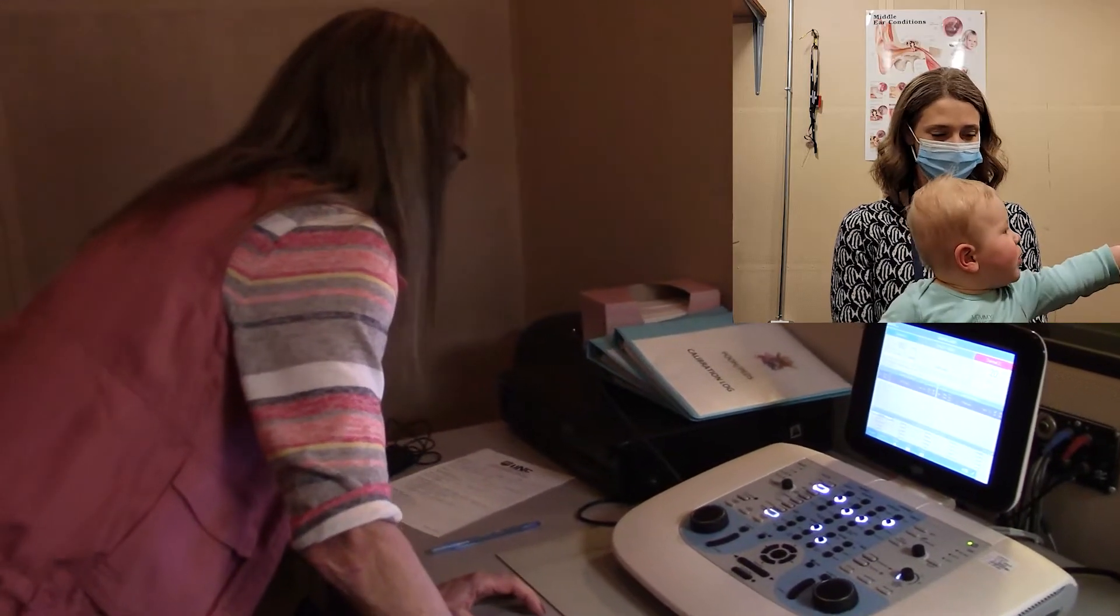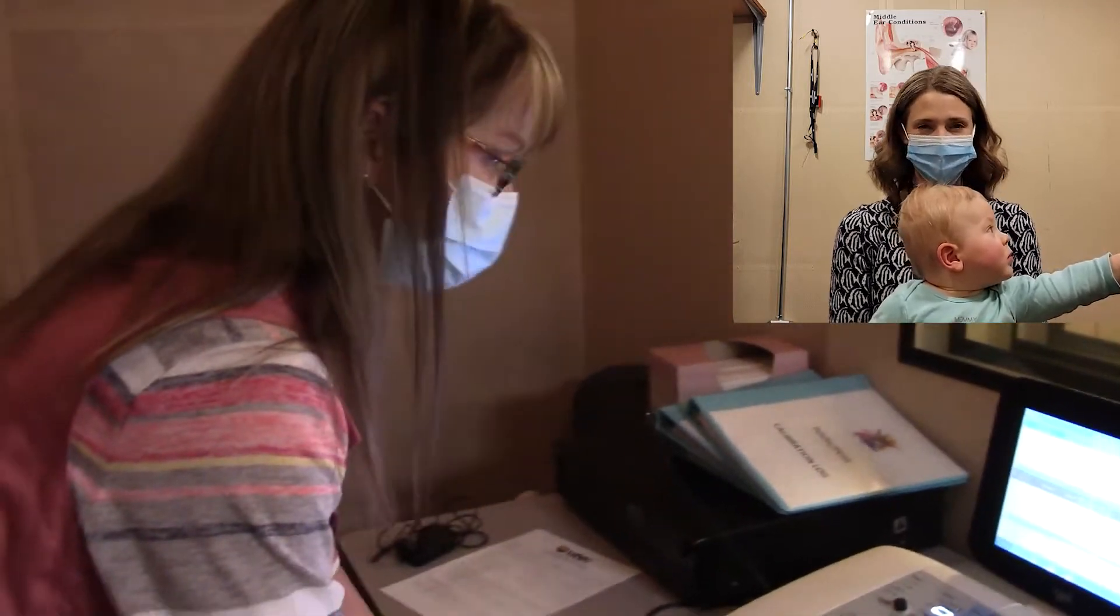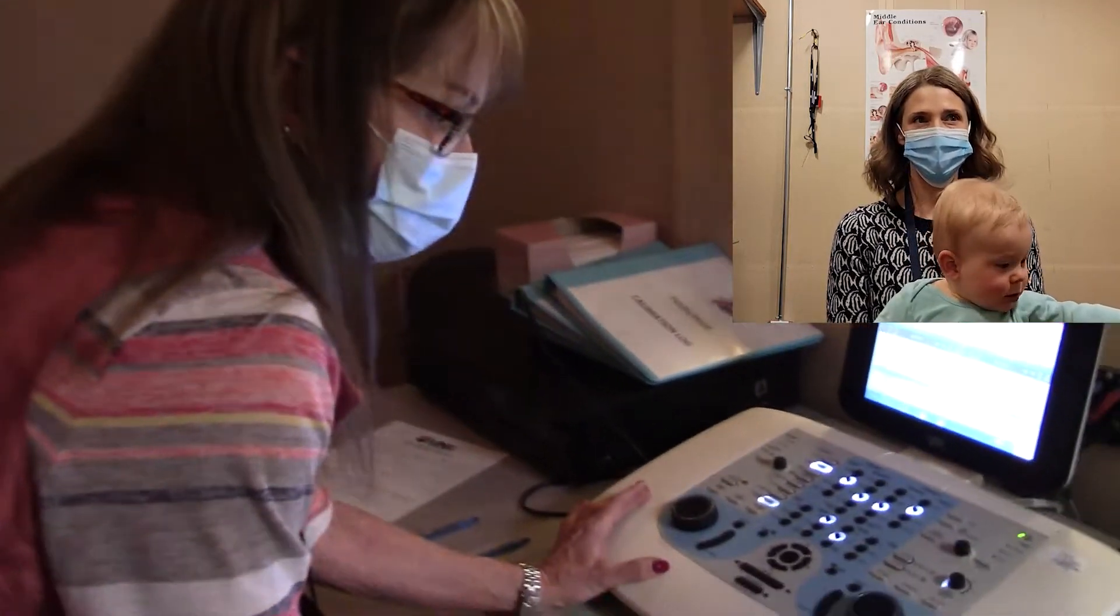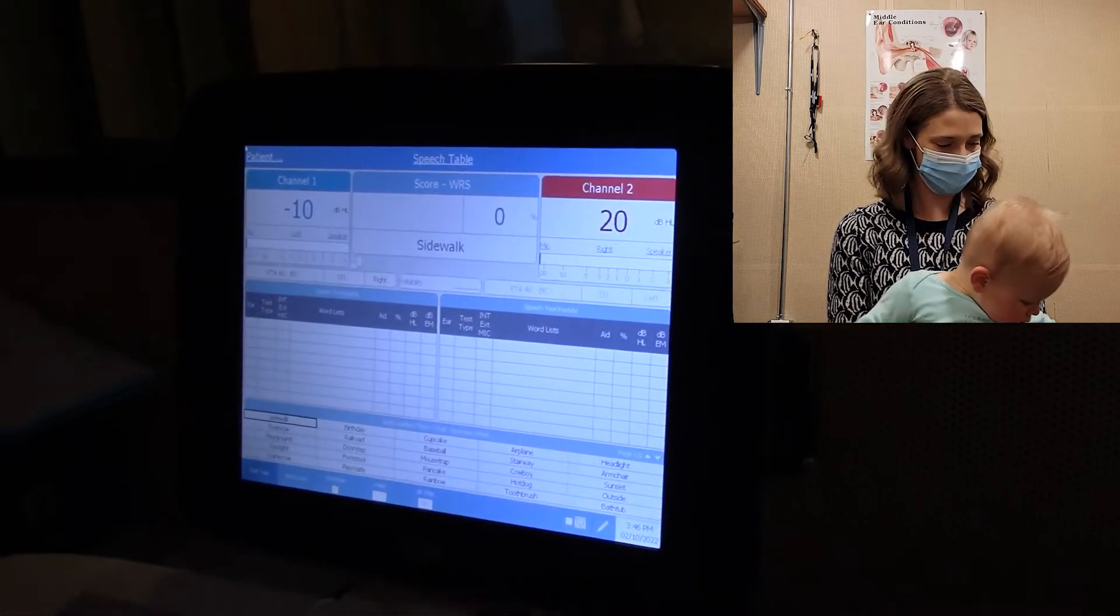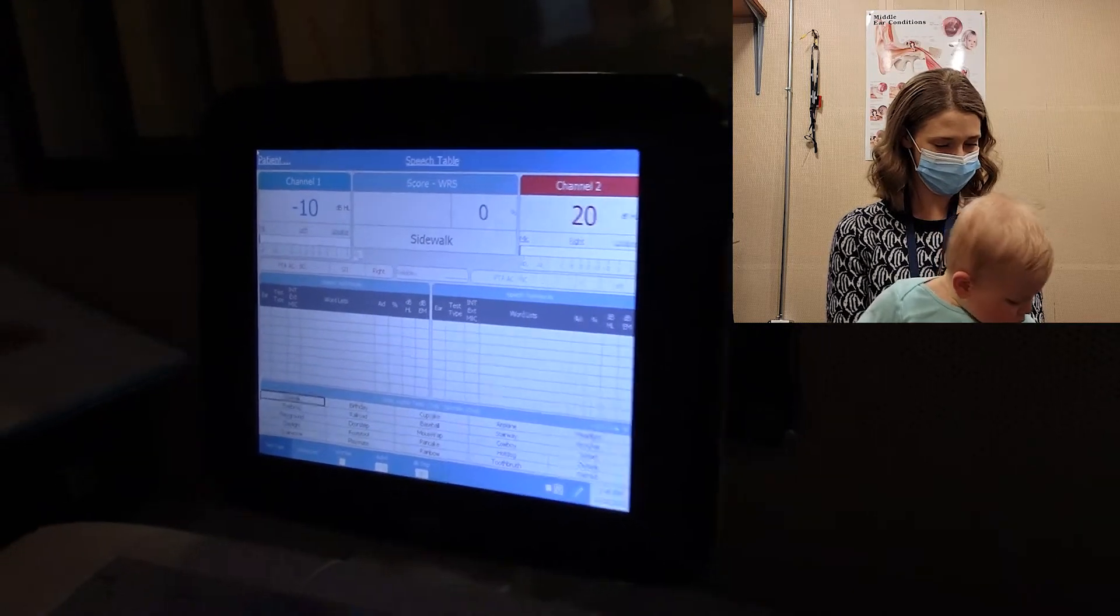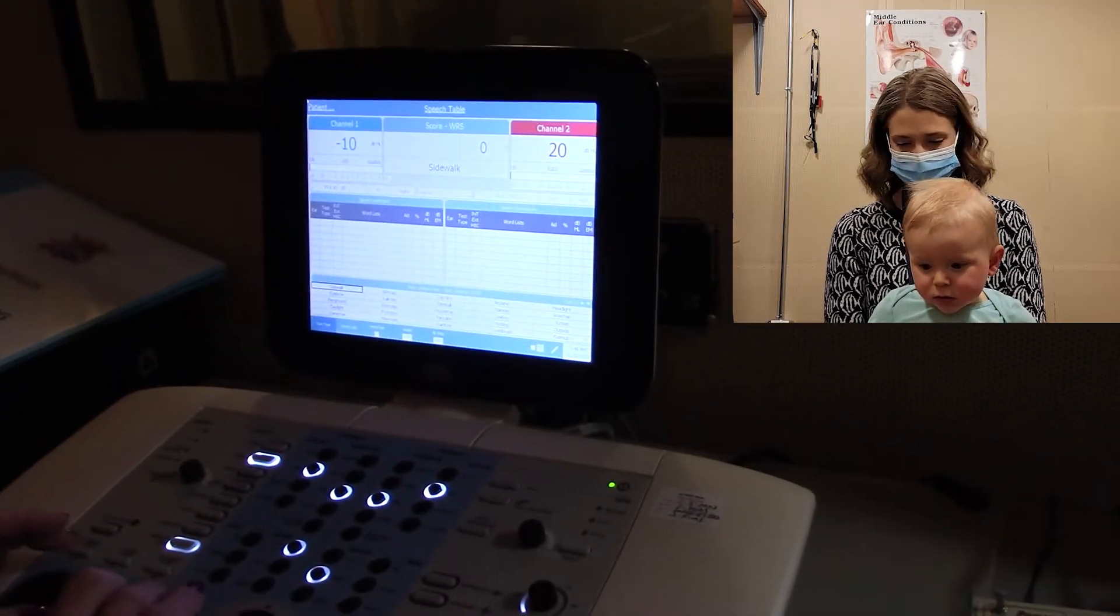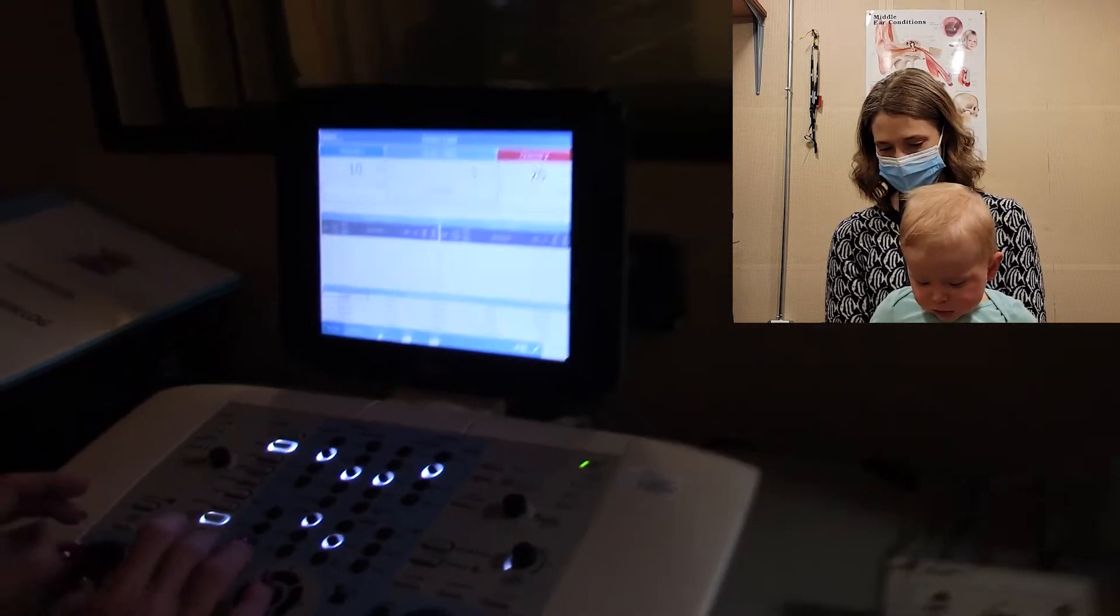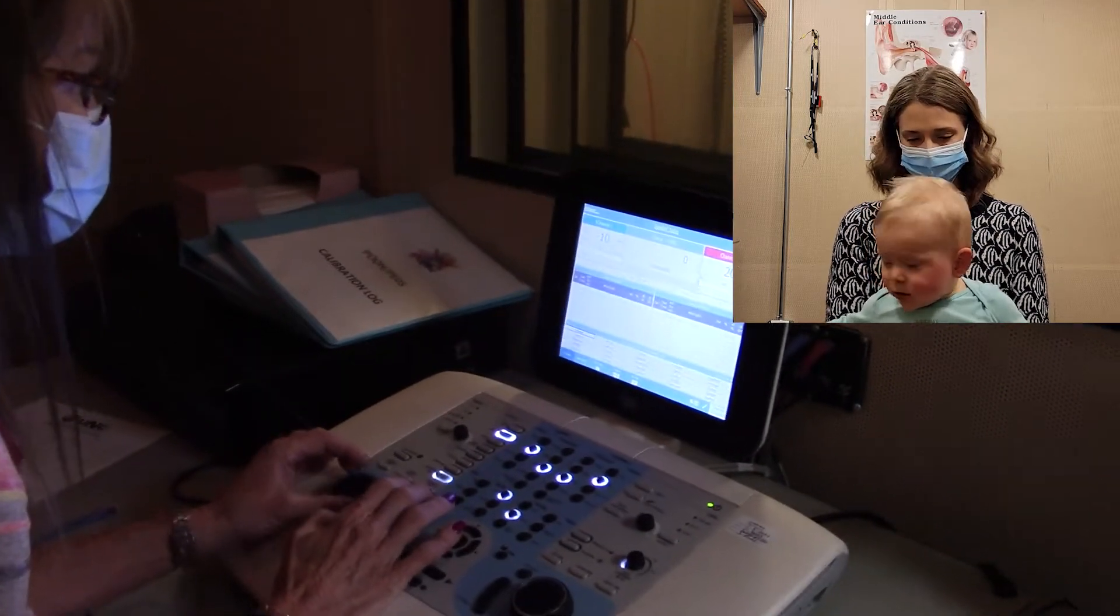We are testing Connor. He is just turned 11 months old. I'm going to start with an SAT. I'm at minus 10. I haven't turned it on yet. I'm going to come out of the left speaker, he's kind of looking right. So we're going to come out of the left speaker and he likes boxes. I'm presenting.